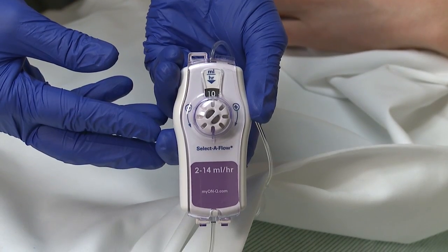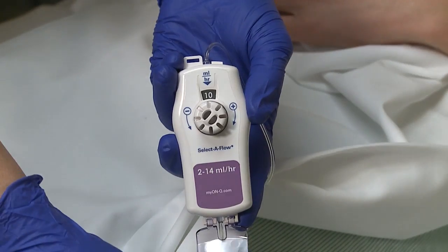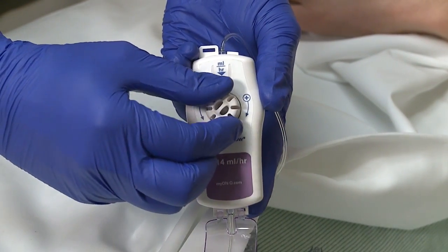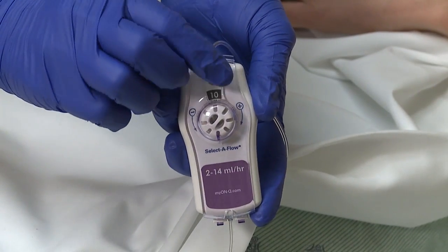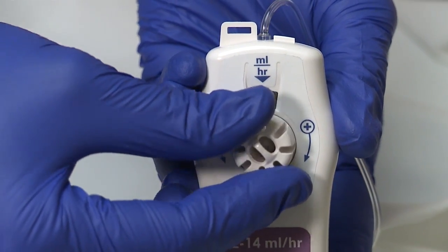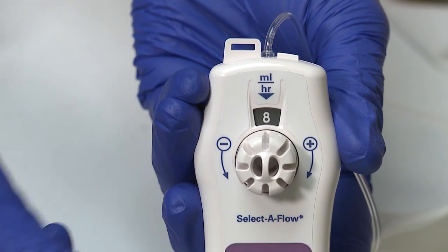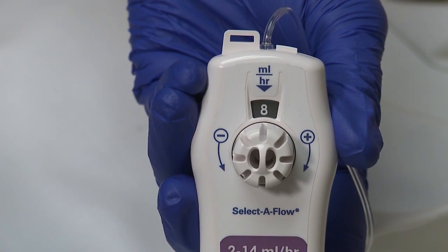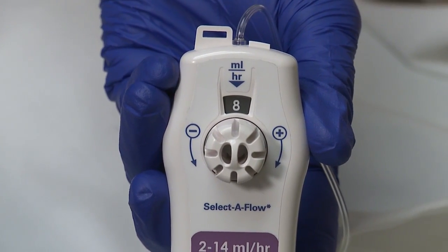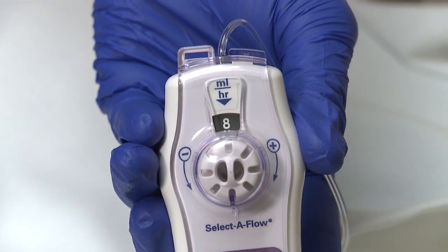The rate dial allows you to control the amount of numbness you want in the area being blocked. It has a range from 2 to 14 milliliters an hour, but a number must be showing on the display for the cover to close properly. Some patients like to turn it up at night to ensure they get a good night's sleep, and then turn it down during the day because they want more feeling and function in their limb. And some patients prefer the opposite, having a higher infusion rate during the day when they're more active to help cover the soreness from physical therapy, and then turn it down at night when they're not moving it as much. It's totally up to you.